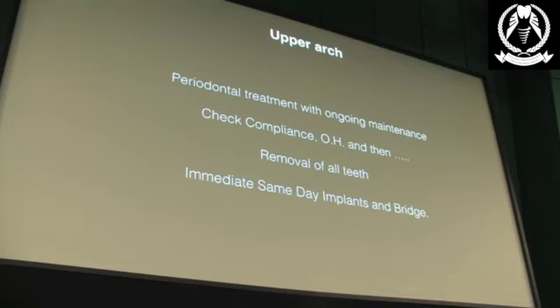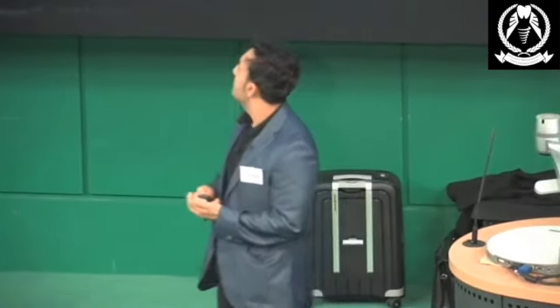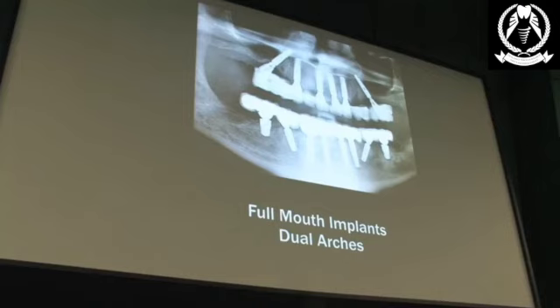With the upper arch, really, we did some periodontal treatment, believe it or not, with ongoing maintenance. We checked how compliant Mr. J would be. We checked the oral hygiene before making that decision sometime later to remove the upper teeth at a separate time. So 2 years later, from here, we've taken him to a complete new upper and lower set of teeth based on dental implants. I'm showing you x-rays here, but I have example cases of the final prosthetics later. We'd broken up the bridge, but I'd not removed that. Now, in this particular case, we used an interesting technique because we avoided sinus lifts on Mr.